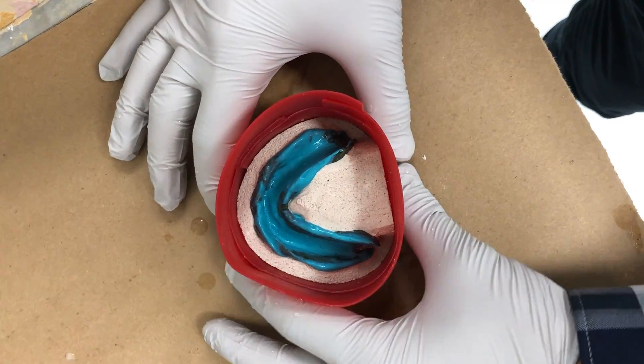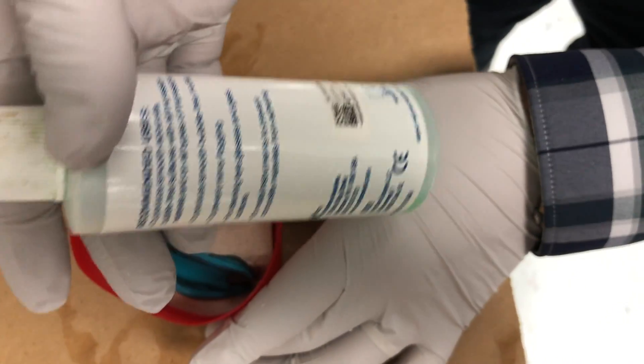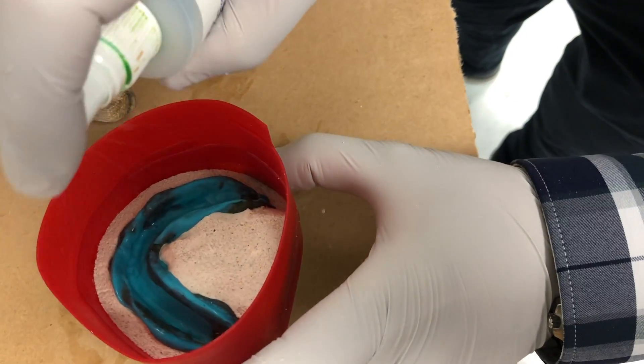If you used PVS to make your impression, use a debubbulizer and spray it on the PVS impression to decrease the chances of getting bubbles on your cast. You should now be ready to pour your impression.